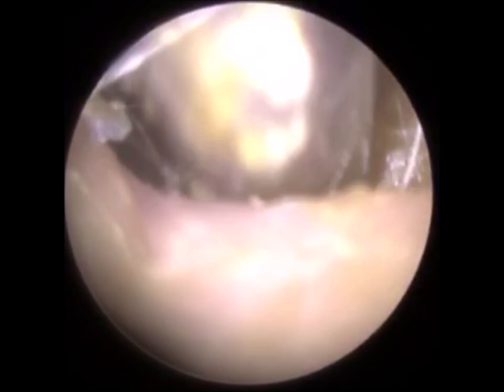And there's the eardrum to the right. You can see it's a bit dampened there again. That dead skin is still oozing a bit of fluid. It's not coming from the perforation, it's just the dead keratin. This is a final view, so there is a bit of keratin left here and there, but you can see how well we've done. We've really removed that. The perforation is visible there.